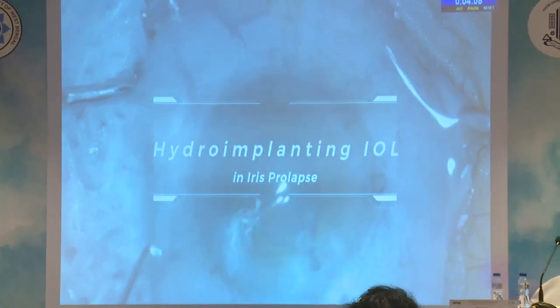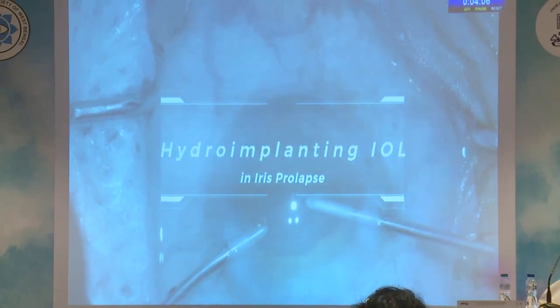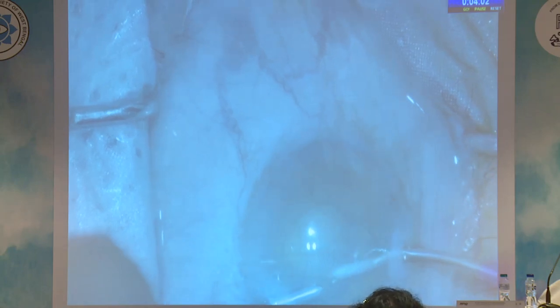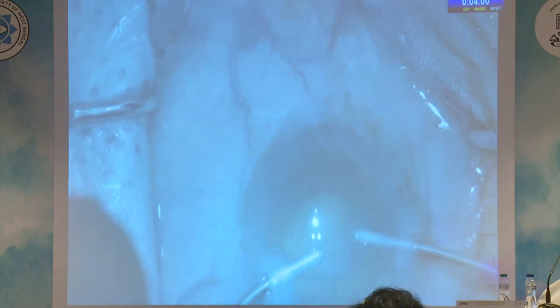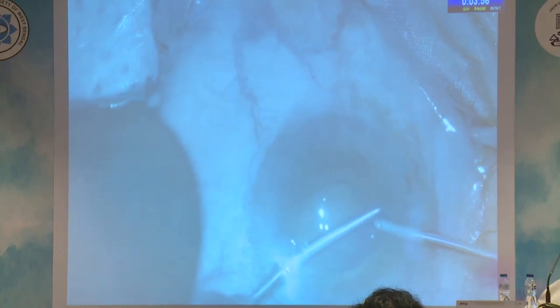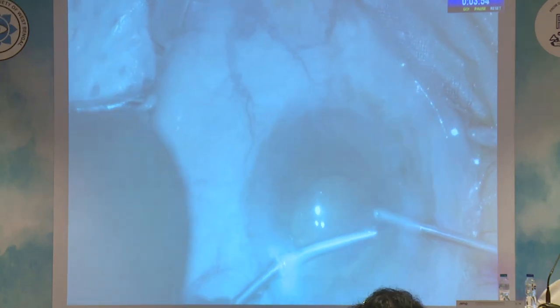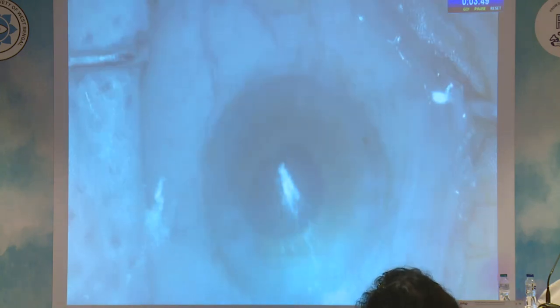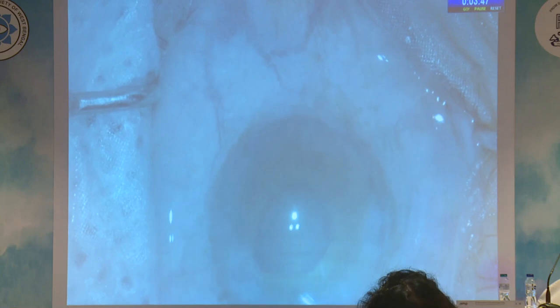Now what we usually do is hydro implantation in the cases where the iris is nicely stable and the pupil is dilated, but in these cases the iris is prolapsed from all the ports, and you can see from the suction port it is coming out, from the main port it is coming out, and when you withdraw the irrigation it is coming out.